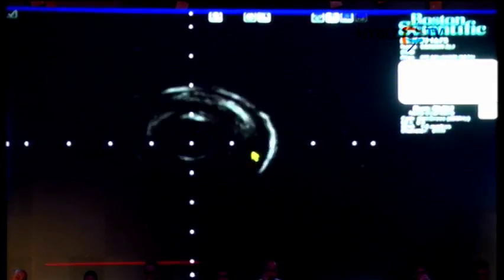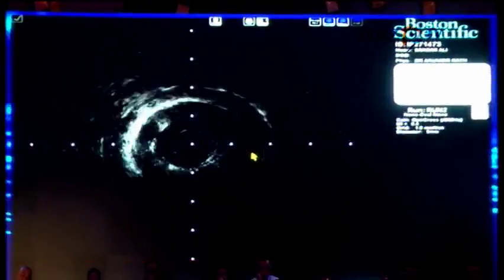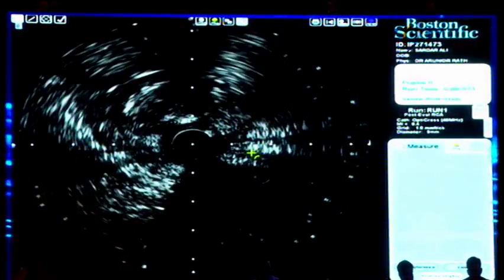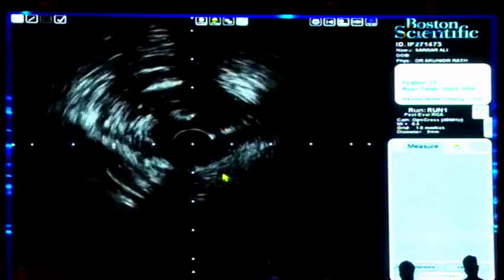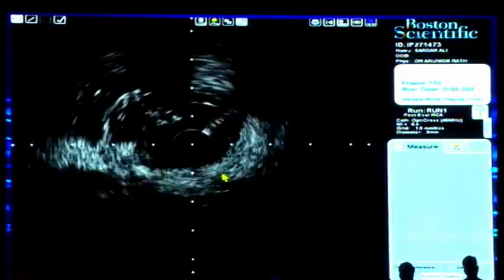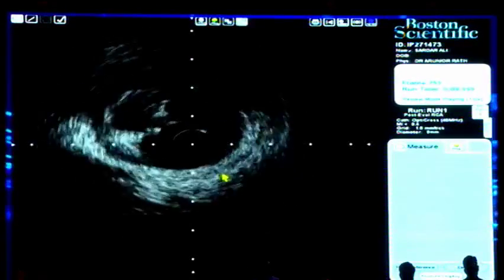Okay, give me a 1.5 balloon. The 1.5 balloon, please. Thank you. Okay, keep it straight. Okay, good. Guys, what's going on? Okay, Arun, tell me.